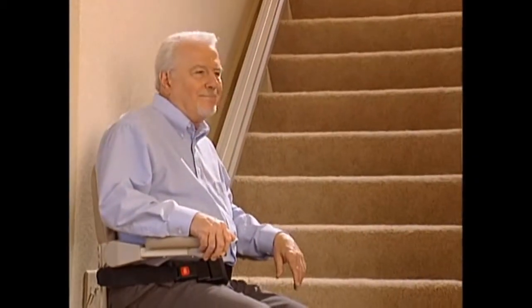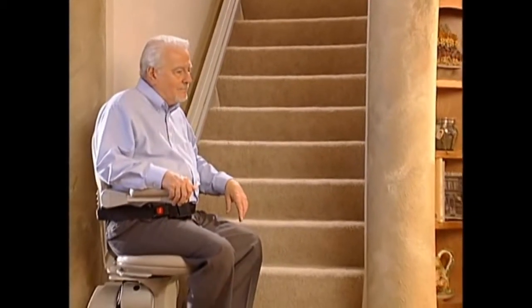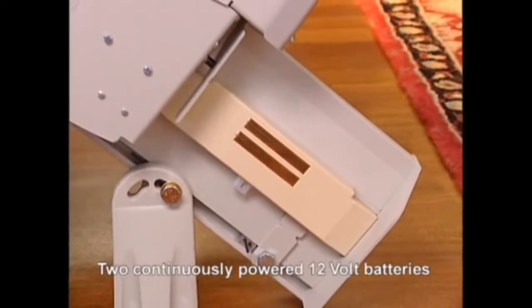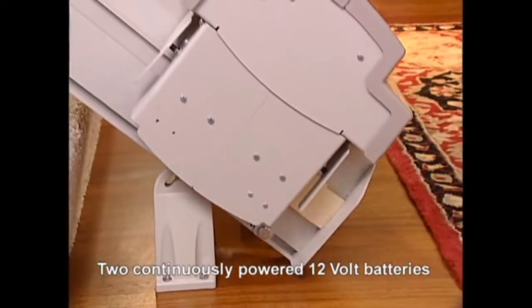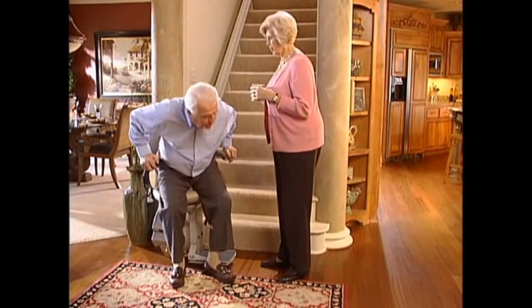And of course, as with all Bruno stairlifts, you never have to worry about being stuck during a temporary power failure to your home. The SRE2010 is equipped with two 12-volt batteries that are continuously powered through a small, unobtrusive battery charger that plugs into any household outlet.